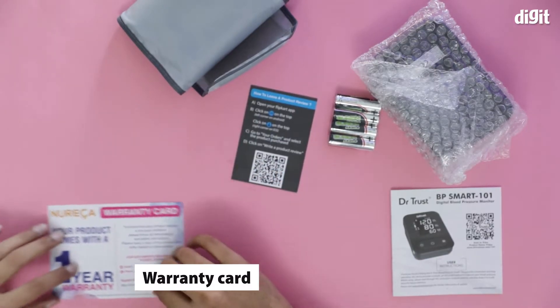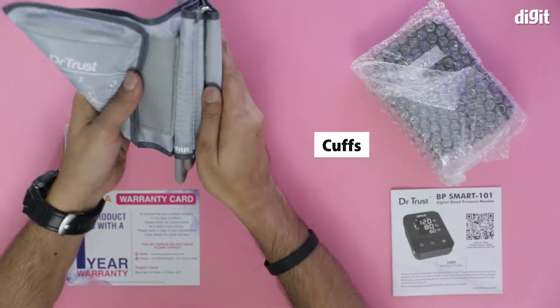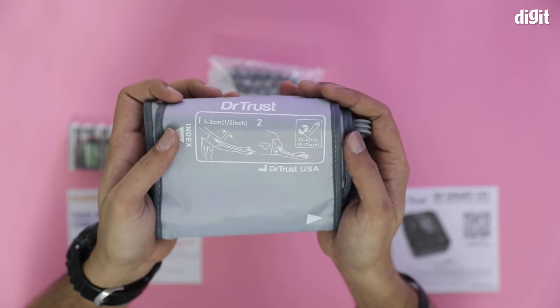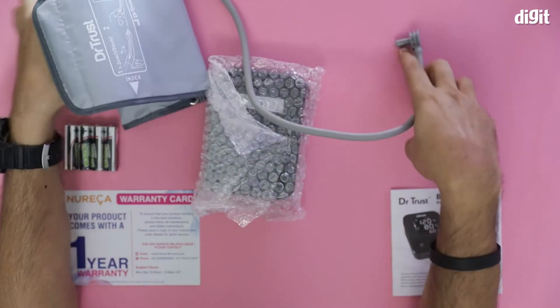There's a warranty card. We also have four double A batteries. And this is the cuff — it's 22 to 42 centimeters or 9 to 17 inches. There is the pneumatic tube, the air tube.